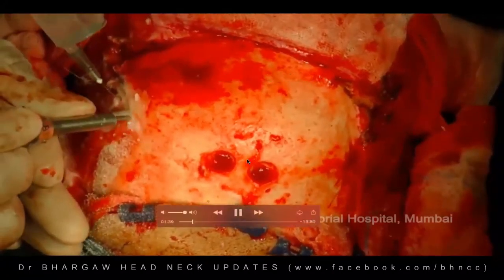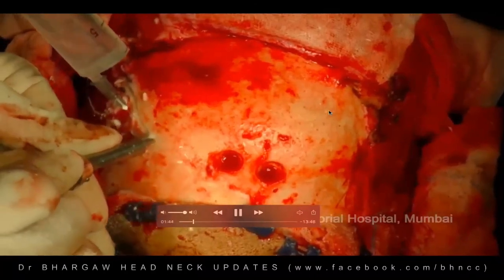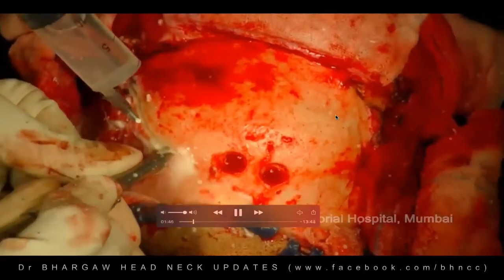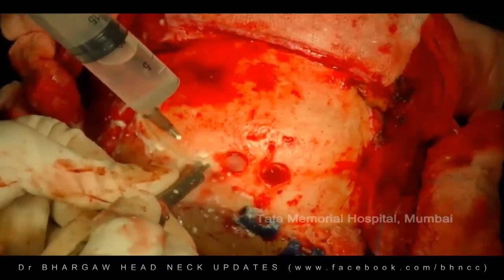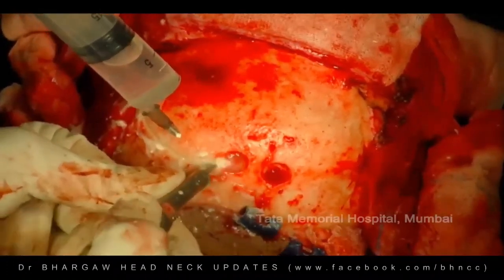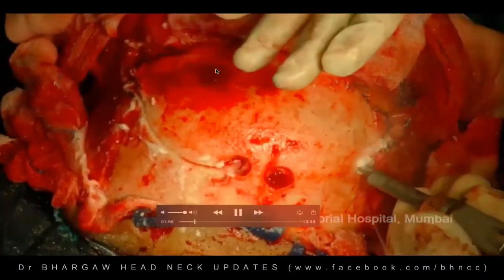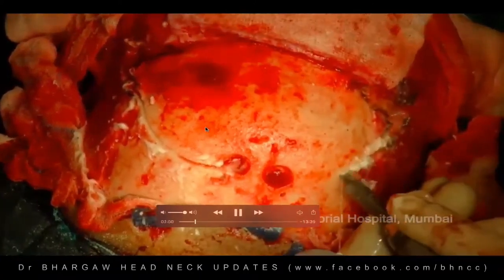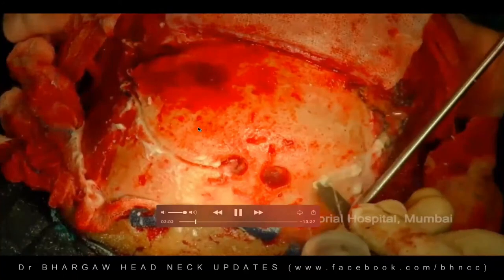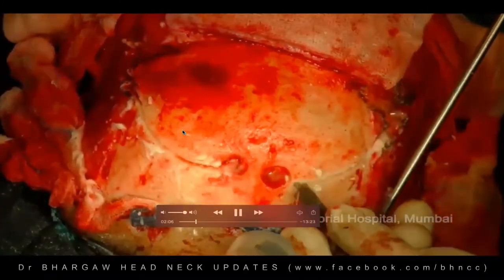It's very essential to go laterally from the pterions and come here, because otherwise you'll not be able to do a proper craniotomy. Once the craniotomy is done, it's very essential to safely keep the bone in a sterile solution, because it has to be used with plates and screws subsequently.